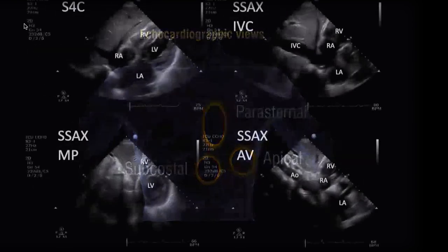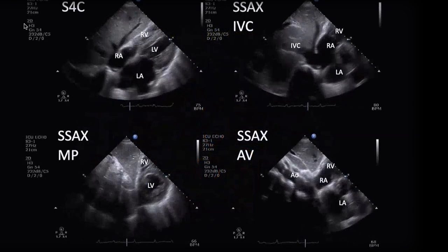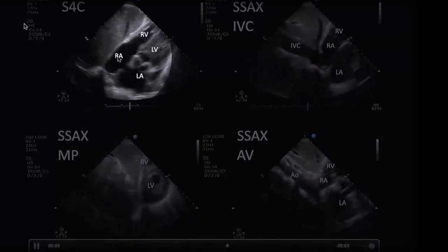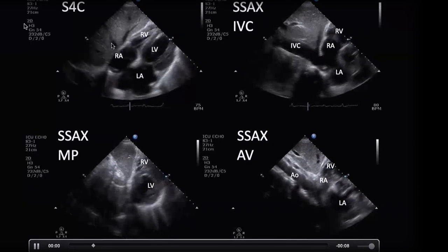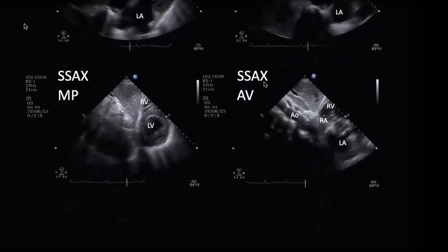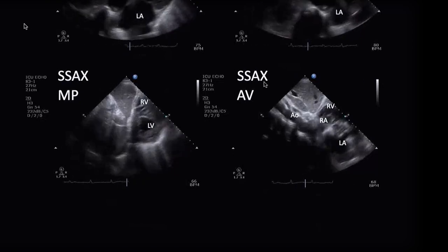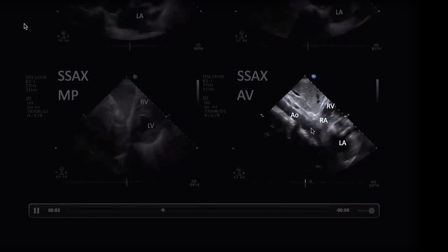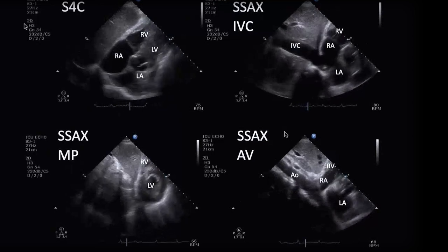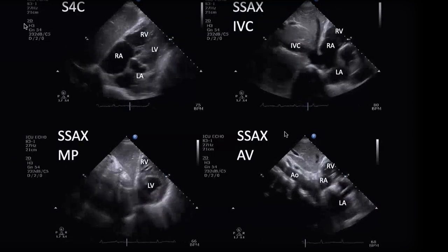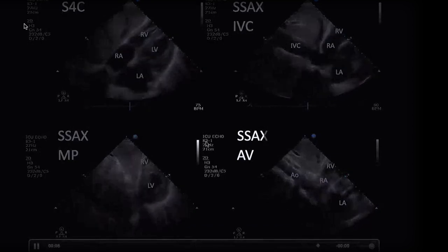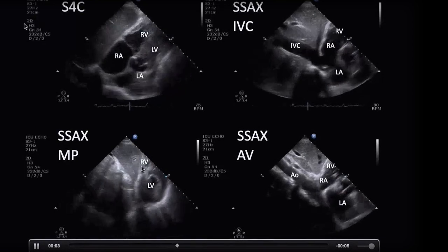The subcostal window — I almost always use a phased array probe. The subcostal four-chamber view looks like the apical four-chamber on its side. Rotating anti-clockwise you'll find the IVC and the middle hepatic vein. Tilting slightly toward the midline picks up the aorta — easy to mistake for the IVC, but the aorta shoots straight off past the right side and doesn't enter the atrium. Sweeping the beam toward the left hip takes you through all the structures seen in the parasternal short axis, sometimes giving a fantastic view when other windows are difficult.